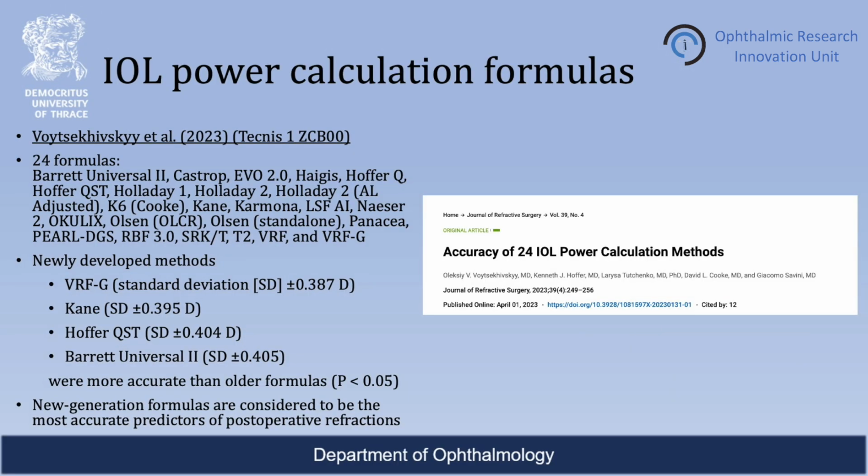As already mentioned, the right formula should be carefully chosen. As regards monofocal IOLs, a representative study using Tecnis ZCB00 proved that newly developed methods were more accurate than older formulas. As a result, new generation formulas are considered to be the most accurate predictors of postoperative refractions.